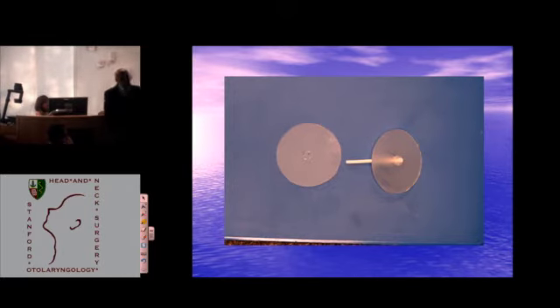So here's a handmade version. It's just a stem connected permanently to one flange, very soft, 20 thousandths thick, and a second flange on the other end where I reinforced it in the center so it would have more drag for the tube, and just a piece of silicone tubing. Next slide. And in this particular, there it is in an adjustable form.